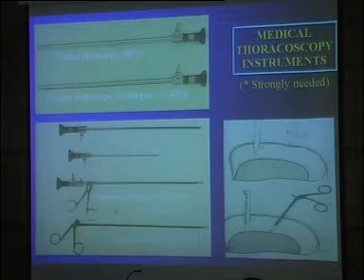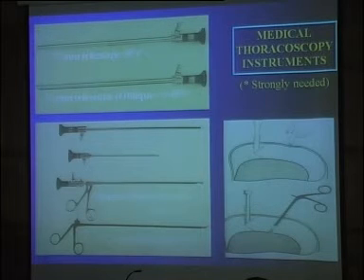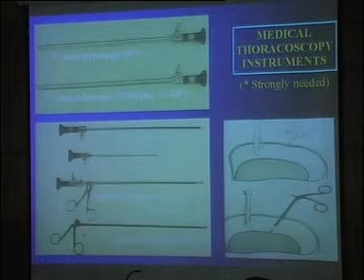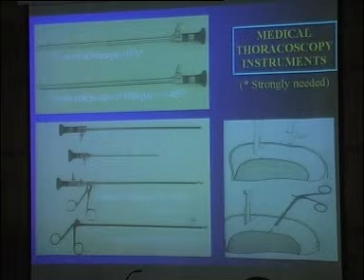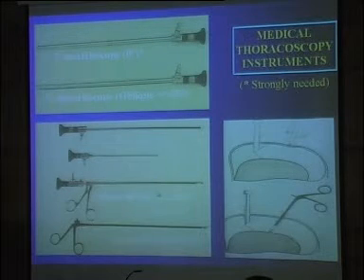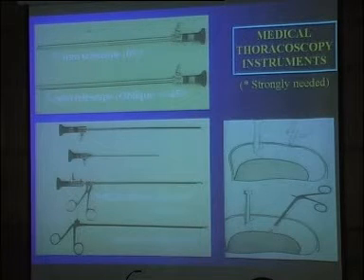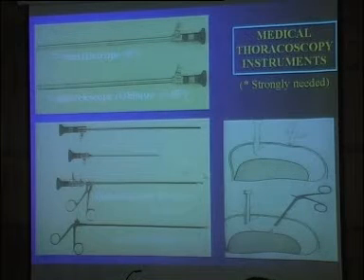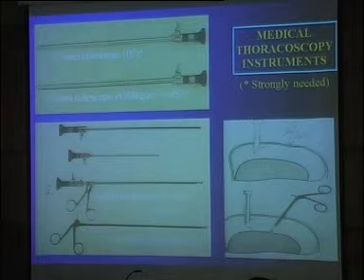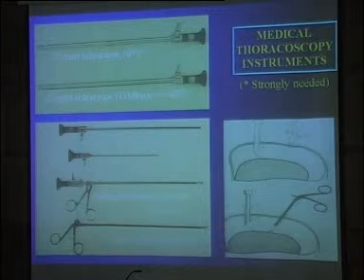My opinion is that it's the most important tool: the optical biopsy forceps. Of course, with this forceps you cannot apply coagulation. To apply coagulation, you have to use this coagulating forceps. You use a 5 millimeter insulated trocar, and you can work with 2 instruments, as you can see here. And the basic requirement, I think, for thoracoscopy is to get this 7 millimeter telescope for a good analysis, and this optical biopsy forceps, because 99% of our procedures are done with this single material, and you absolutely have to get this optical biopsy forceps.